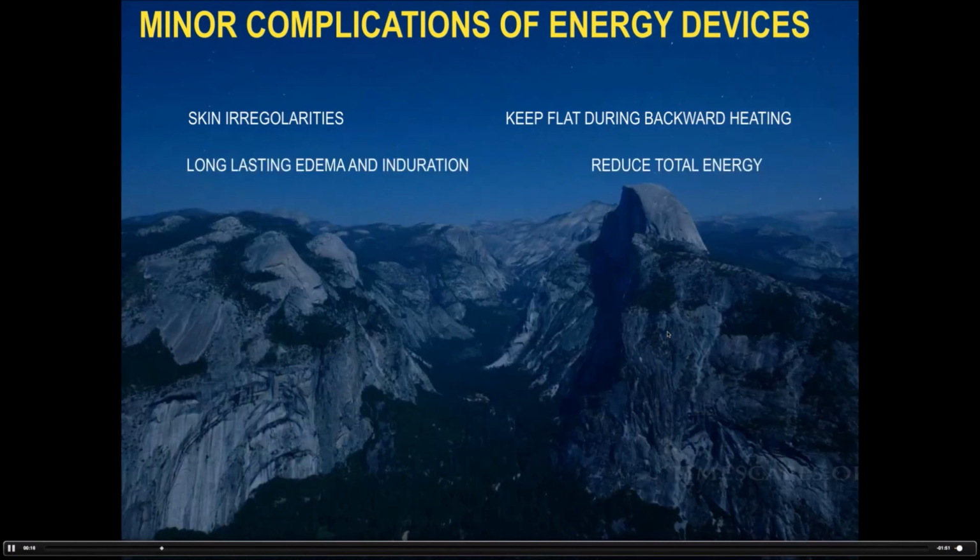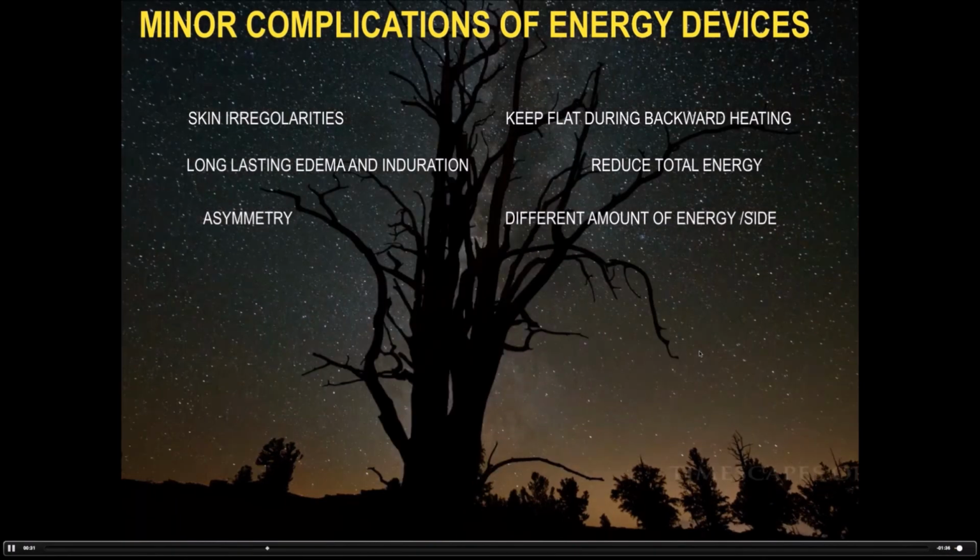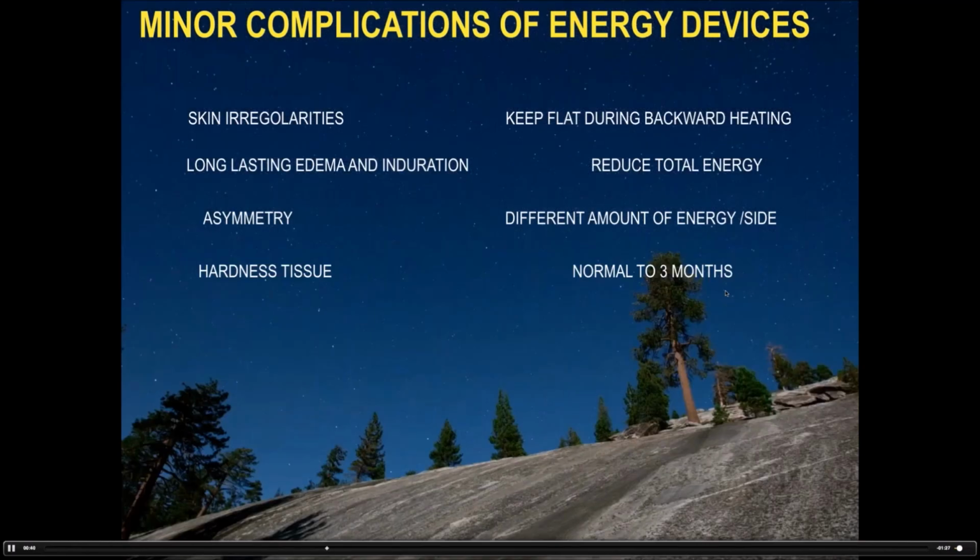Asymmetry: maybe you didn't apply the same amount of energy from one side to the other. Please remember, you have a counter. Check the left and right sides; they must be the same if it's not asymmetrical. Patients should be told beforehand that hardness of tissue is normal, for up to 3 months. But this is our check of our treatment.